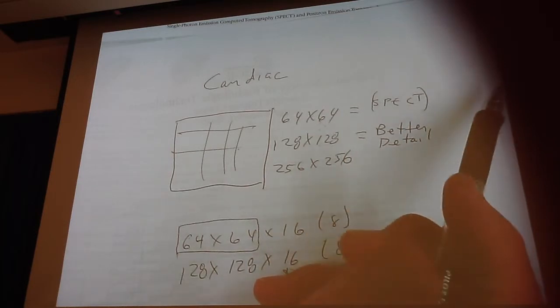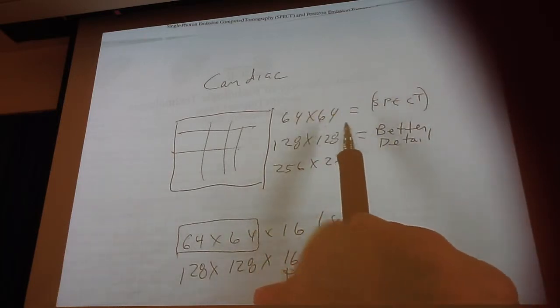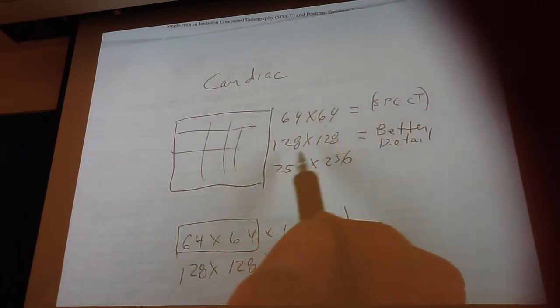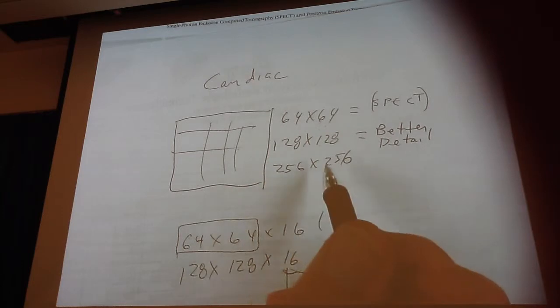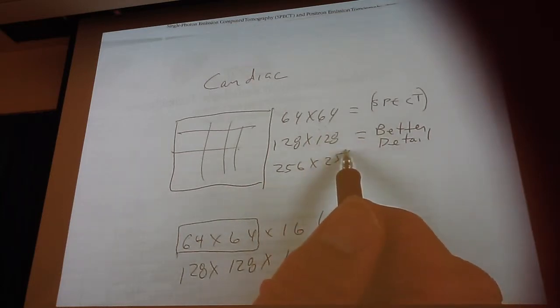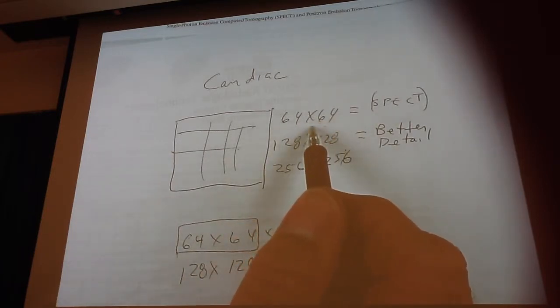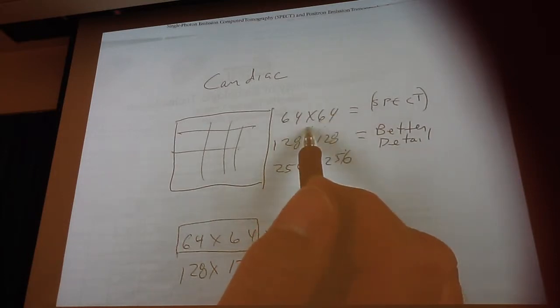Unfortunately, you guys are coming into nuclear medicine where year after year after year, it was sort of taught by word of mouth. And this is what kind of scares me, because people are using protocols that are on their computer for studies that we may not even do anymore. What I mean by that is there are people using thallium protocols for sestamibi studies. But how do you know? Could you look at your computer and say, oh, this one is for sestamibi and this one is for thallium? Could you honestly do that?